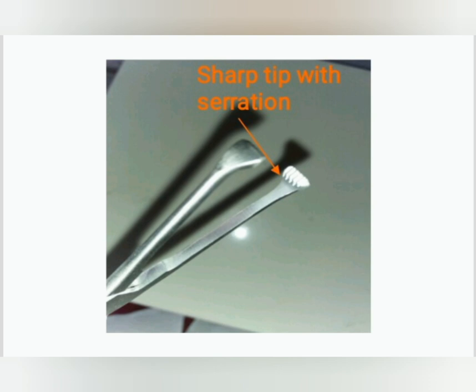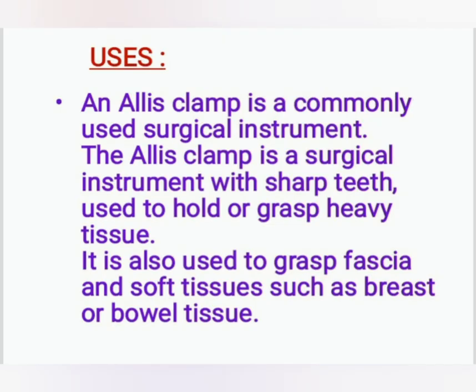The sharp tip of the Allis forcep is very useful during procedures for grasping and holding tissue. The Allis clamp is a commonly used surgical instrument with sharp teeth, used to hold and grasp heavy tissue. It is also used to grasp fascia and soft tissues such as breast and bowel tissues.